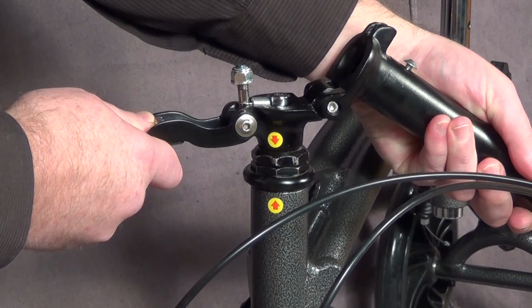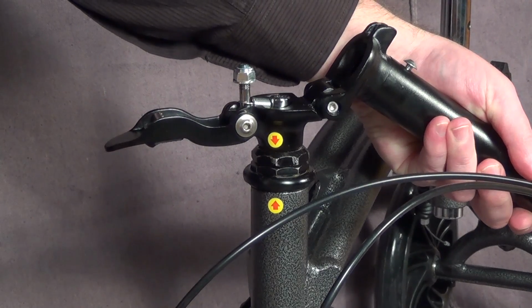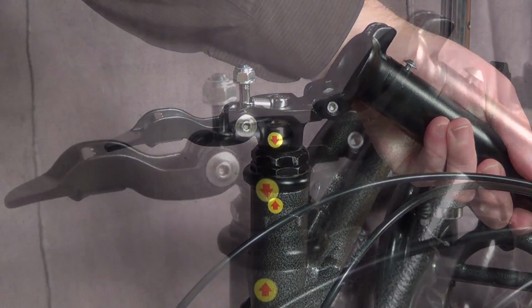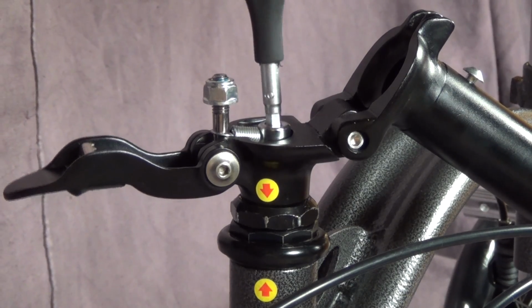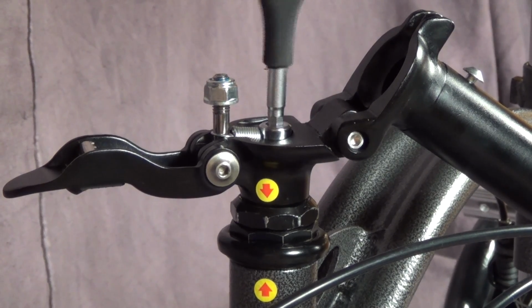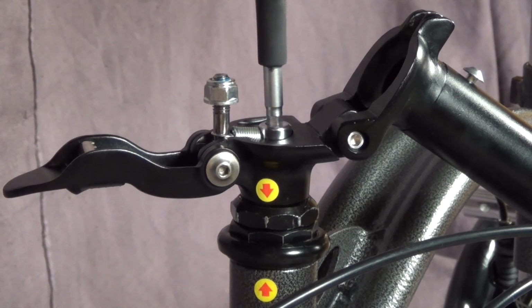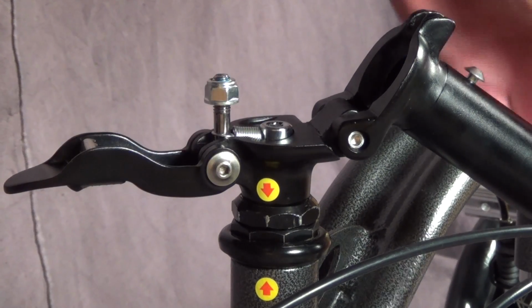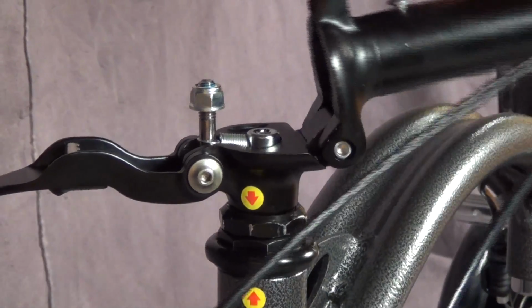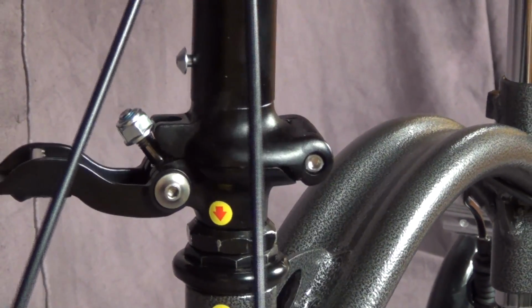Make sure the arrow on the frame lines up with the arrow on the steering column. Use a 6mm hex key to tighten the steering column locking bolt. Fold the tiller back up and lock it into place.